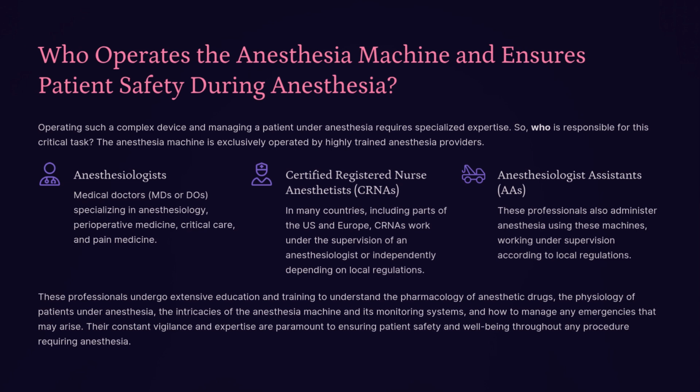In many countries, including parts of the US and Europe, certified registered nurse anesthetists, CRNAs, or anesthesiologist assistants, AAs, working under the supervision of an anesthesiologist or independently, depending on local regulations, also administer anesthesia using these machines.